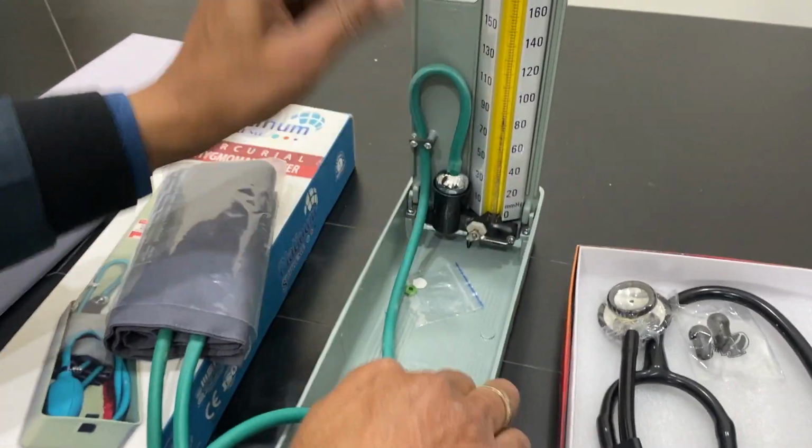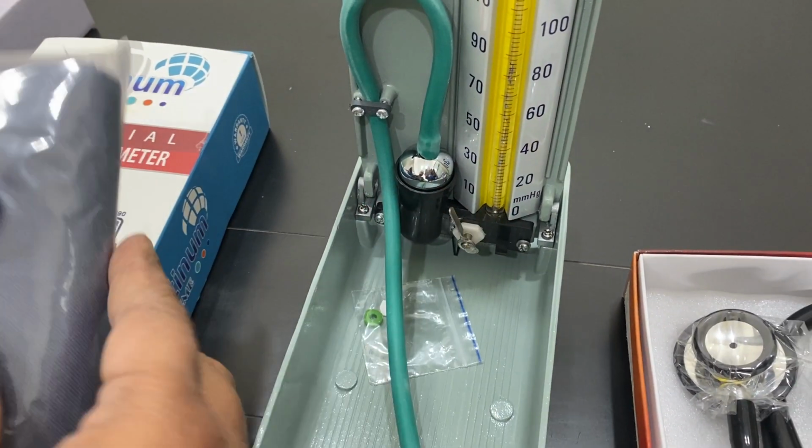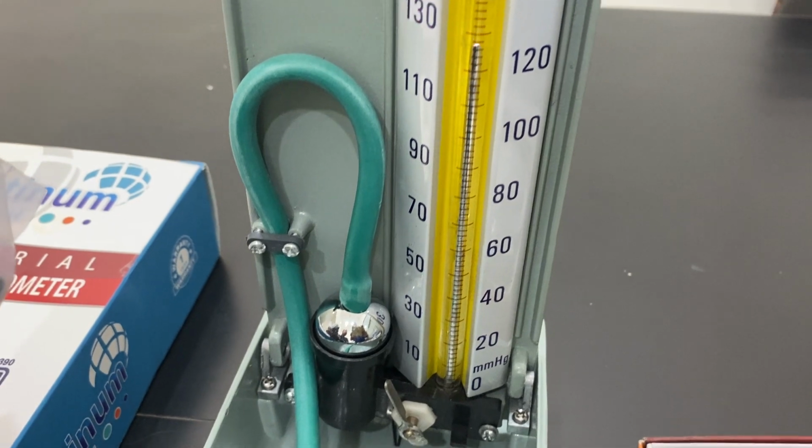And when you have to use it, first switch this on, so mercury can come here, and then the air is filled inside and close this bellow. When you push it, the mercury comes to the top.